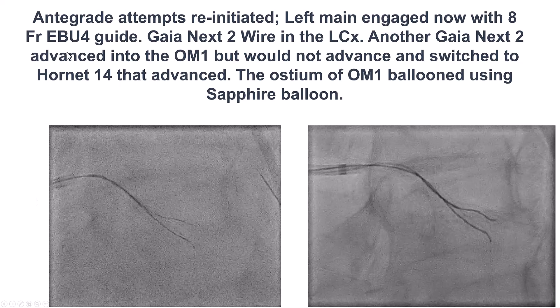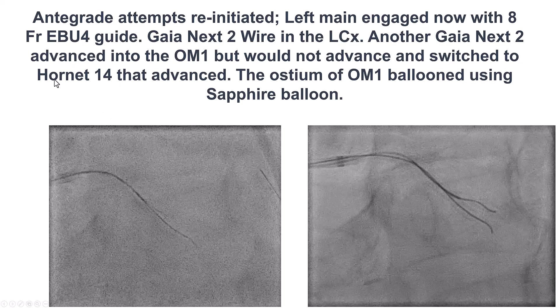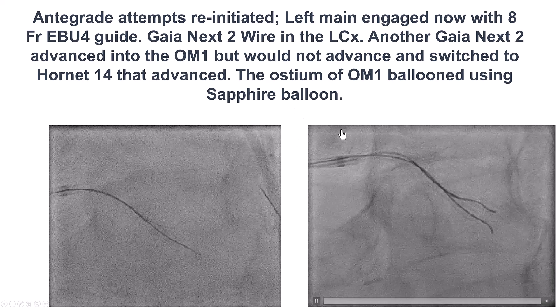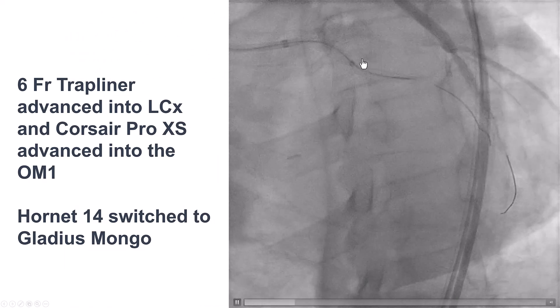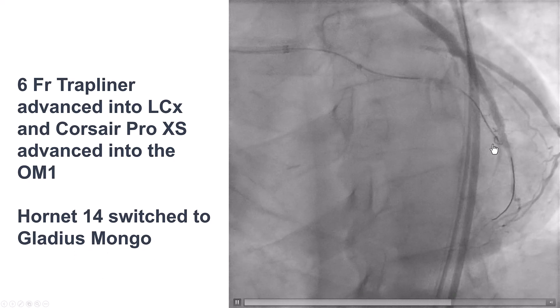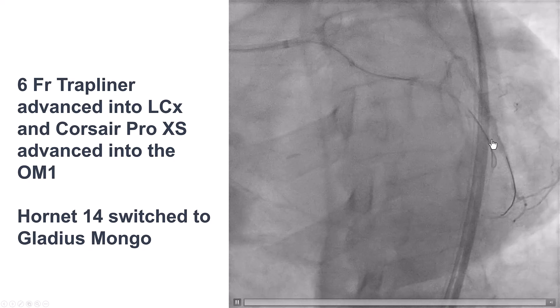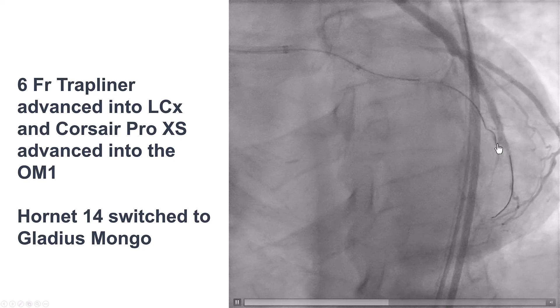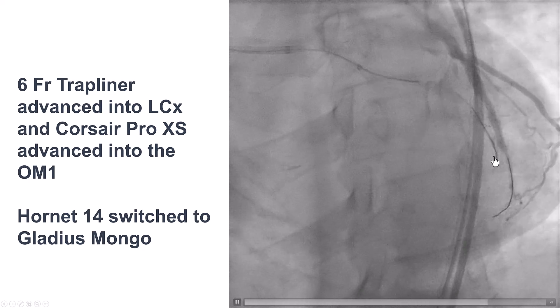We used a different guide catheter — initially a smaller guide, then an EBU-4 that provided much better support. We used a Gaia Nex wire, then increased penetrating power with a Hornet 14 that advanced inside the previous stent. We used a sapphire balloon for predilation, a Trapliner guide extension advanced into the proximal circumflex, and changed to a polymer-jacketed Gladius Mongo that advanced along the course of the vessel. The anatomy became much clearer — this is the obtuse marginal branch, with tenting of the native vessel from the bypass graft.